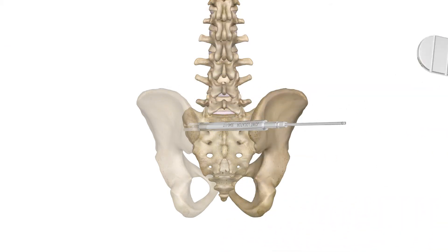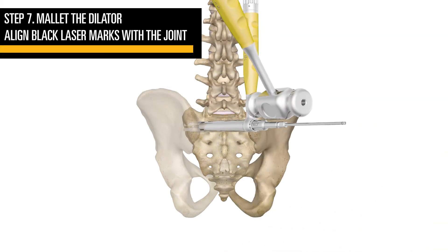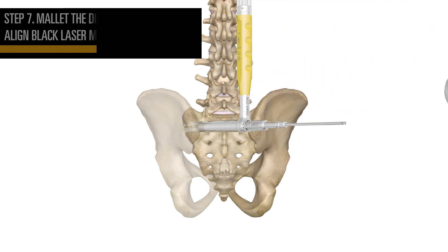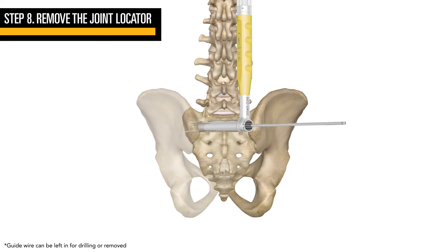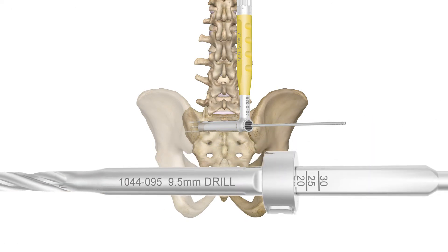Next, slide the dilator attached to the dilator handle over the joint locator and mallet the metal portion of the handle. Using a T-handle, remove the joint locator from the joint. The guide wire can be left in for drilling or removed.